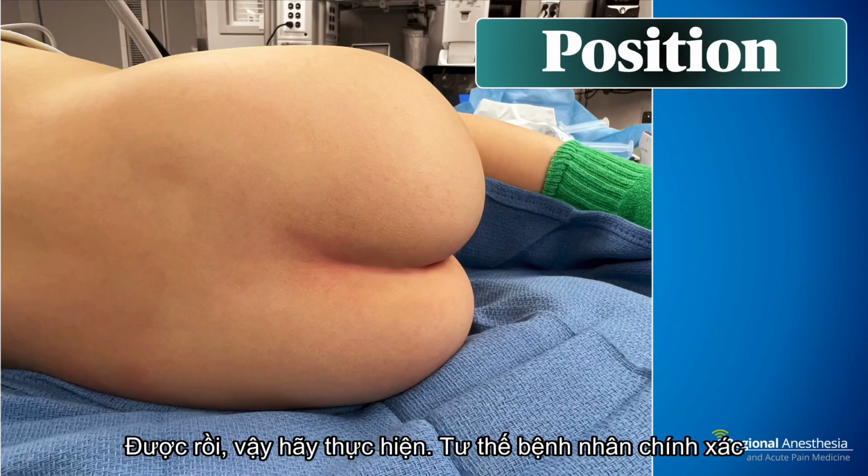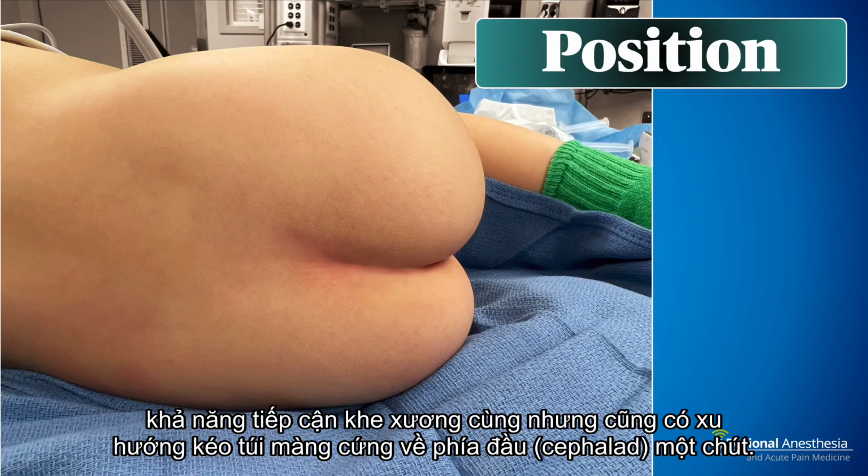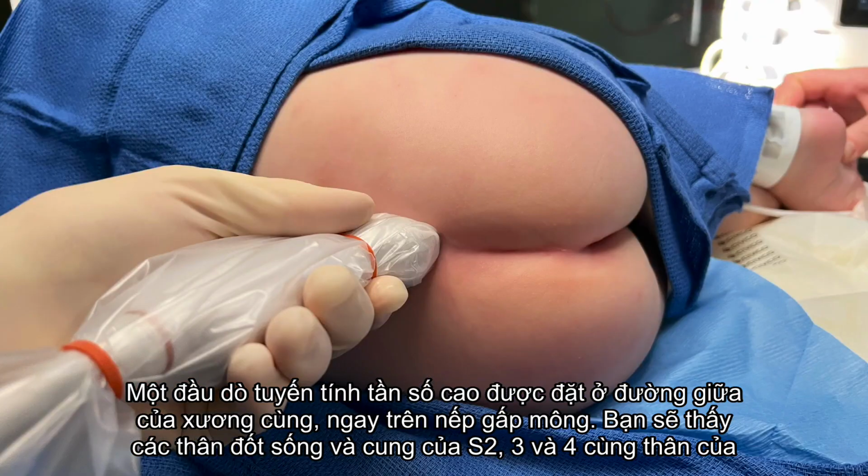The patient position is exactly the same as the landmark block. Patient on their side with the hips and knees flexed. This provides access to the sacral hiatus, but also tends to pull the dural sac cephalad slightly. A linear high-frequency transducer is placed over the midline of the sacrum, just cephalad to the gluteal cleft.